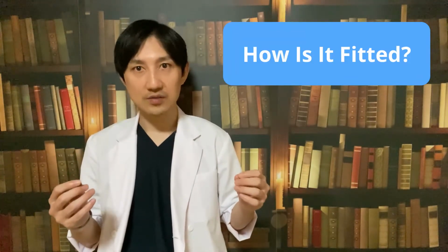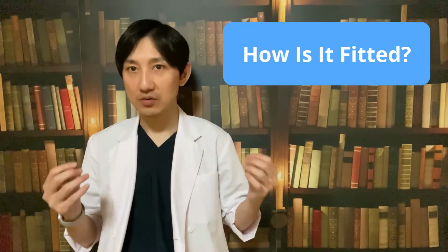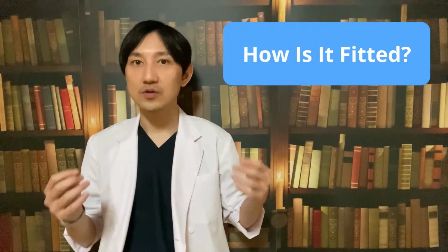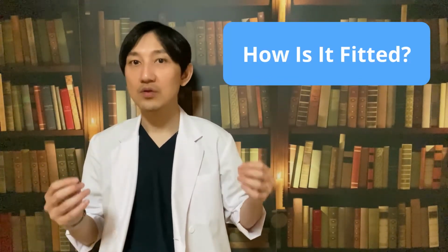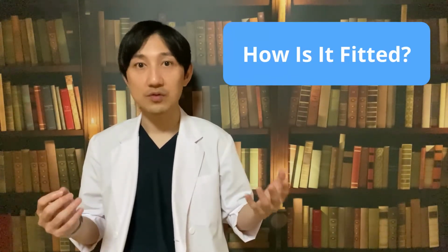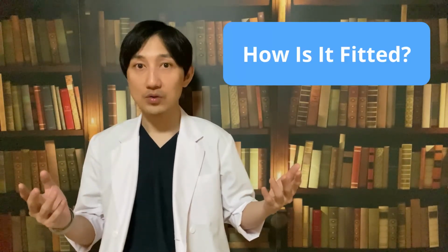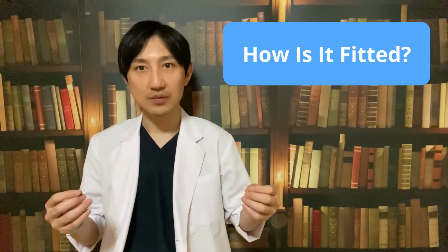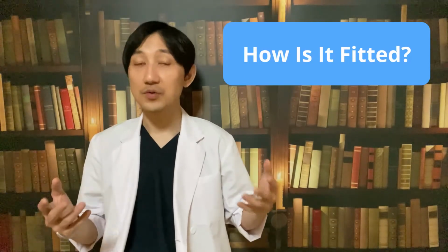If you have had sex before you can get to the clinic for a checkup, take emergency contraception. You should also go back to the clinic if your partner says he can feel the IUD while you are having sex. You also have to go back to the doctor 3 to 6 weeks after the IUD is fitted so that they can make sure everything is working properly. You can tell them about any problems you are experiencing then, and if necessary, you can get the IUD removed.